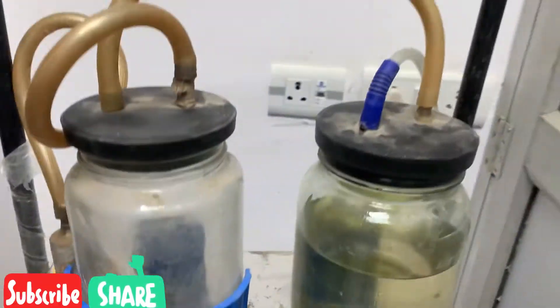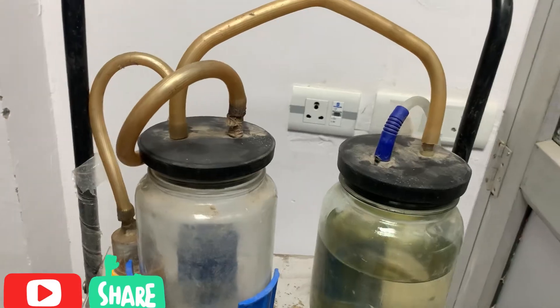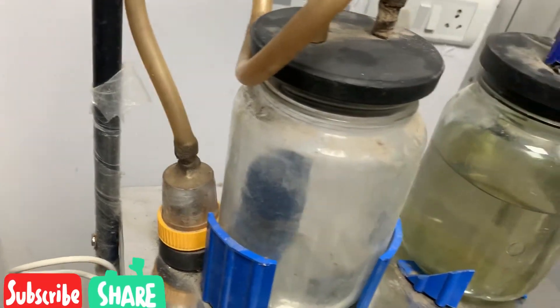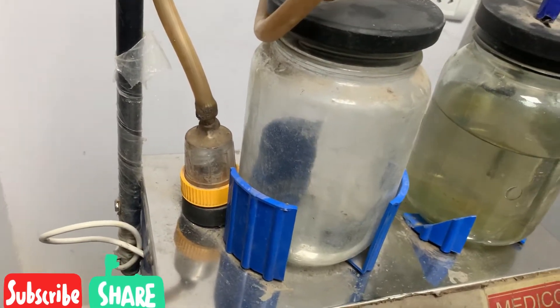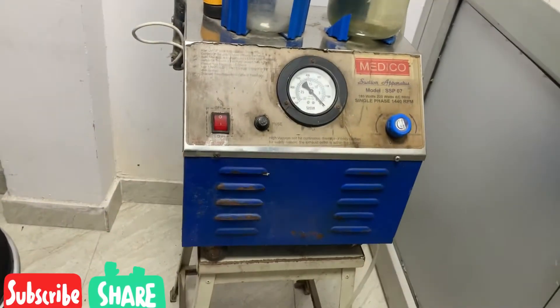This is the vacuum control if you want to increase or decrease the vacuum. And then these are the vacuum jars. This is the filter — it is used to prevent the flow of any liquid or any substance back into the machine.